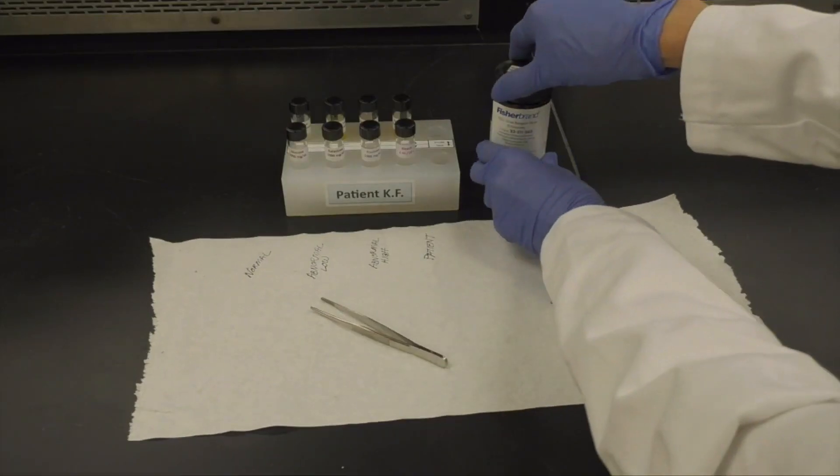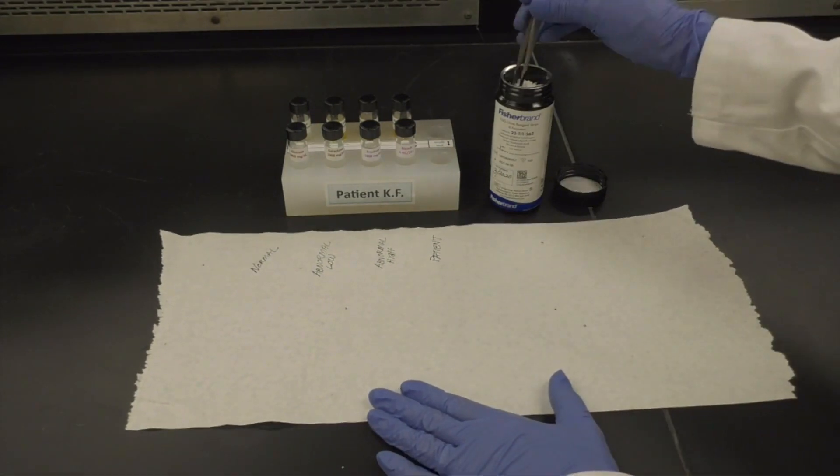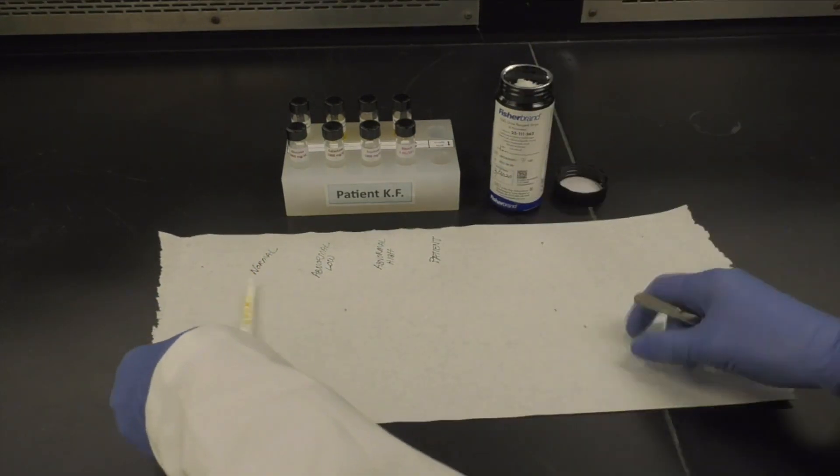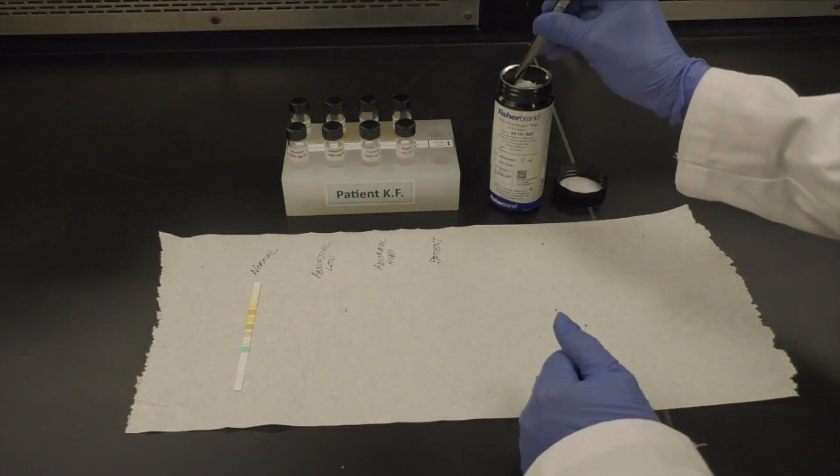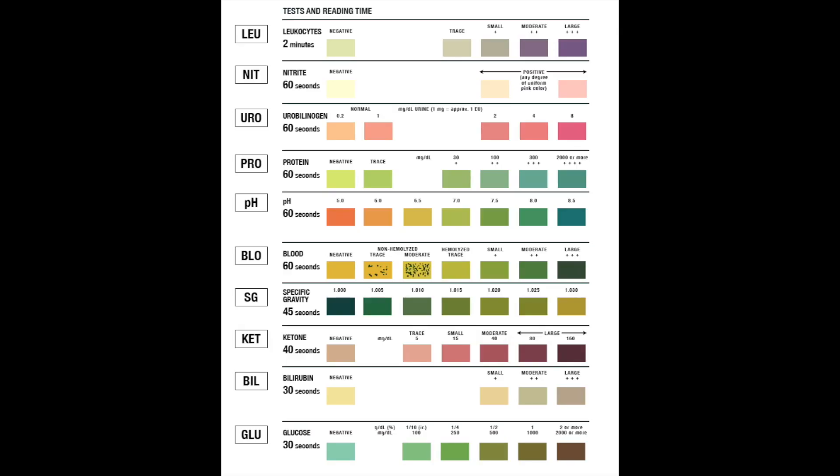We recommend using a paper towel as a background to improve your ability to read the colors and as a way to label the strips. Be aware that you may only need to read specific pads depending on the tests you are interested in interpreting. Refer to your technical guide for specifics.